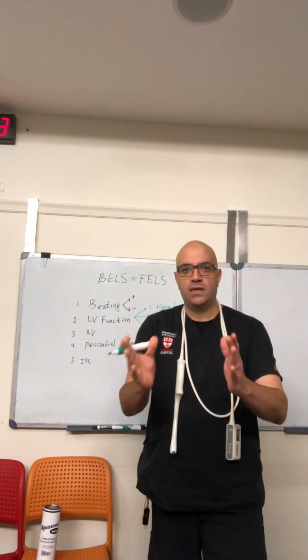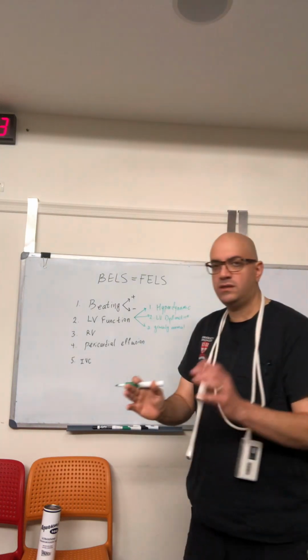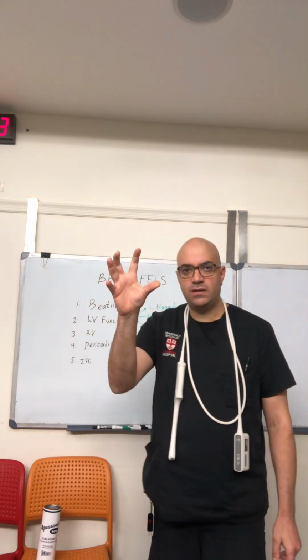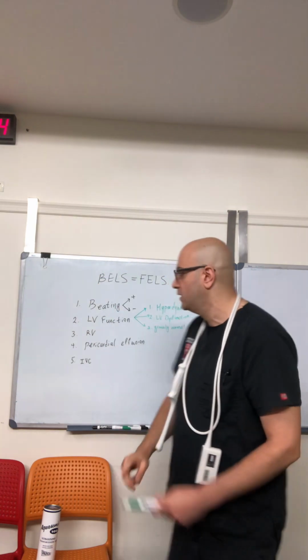Hyperdynamic is when the LV walls are kissing each other. It's very important to differentiate between tachycardia and hyperdynamic. LV dysfunction is when the LV is not moving much.